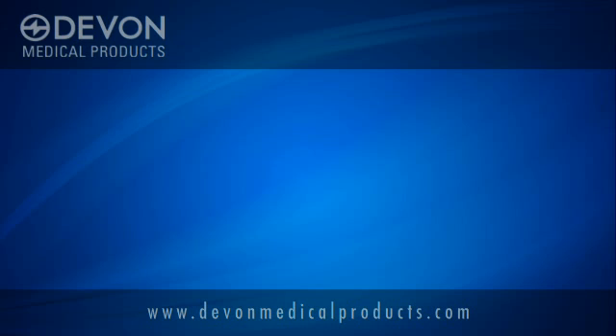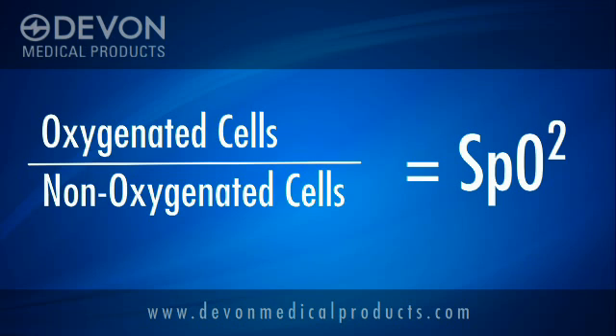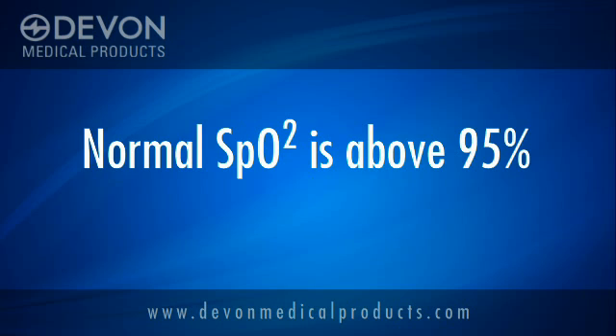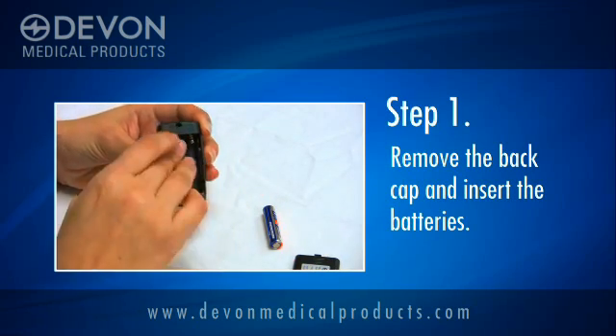The pulse oximeter obtains the ratio of oxygenated cells to those that are not, and returns a percentage known as SpO2. A normal SpO2 is generally above 95%, but can be lower in patients with certain conditions. To begin using the pulse oximeter, remove the back cap on the unit and insert the batteries as shown here.